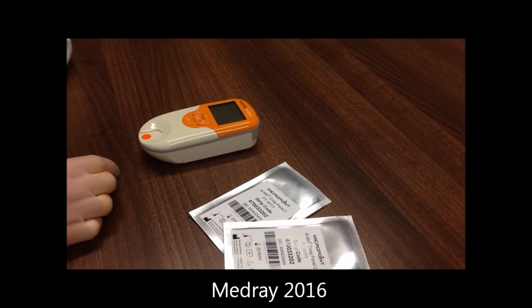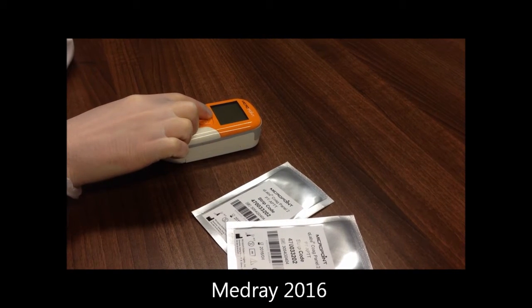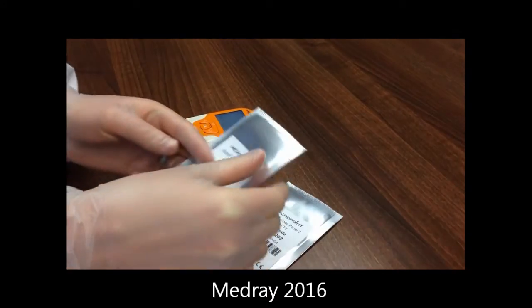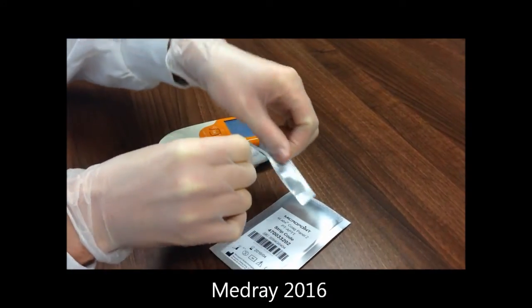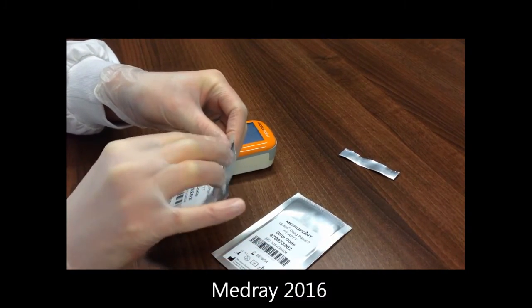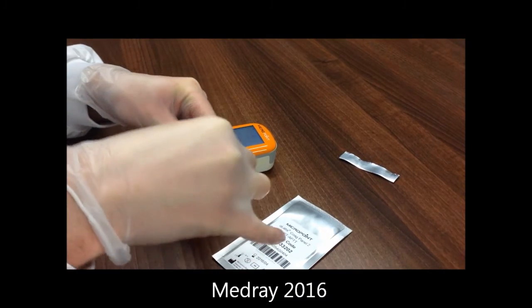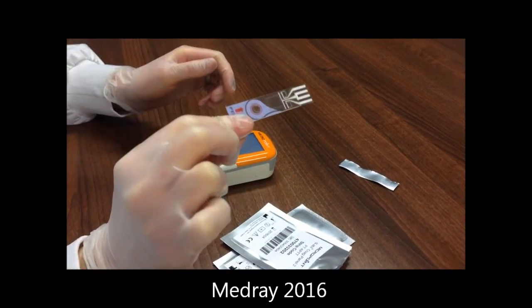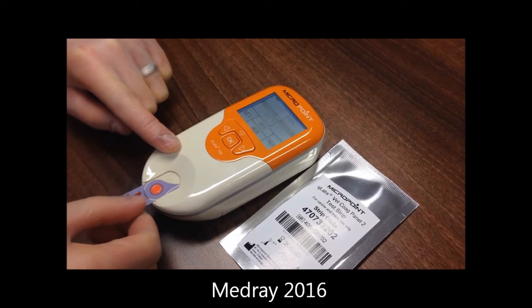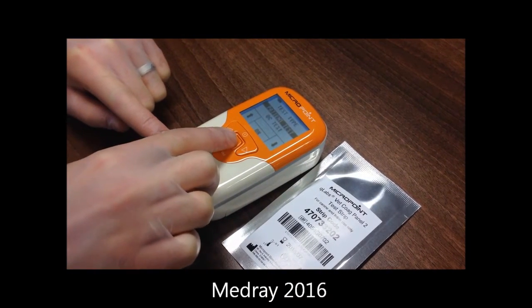Switch the analyzer on by holding the power button or inserting a new strip. The strip should be removed from its foil pouch without touching the sample area or electrodes with your fingers. With the strip inserted, select Patient Test and enter your patient ID as demonstrated.